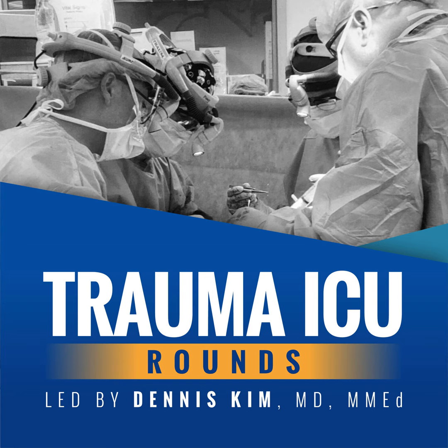So when patients come in really sick, what I have noticed at times is that in addition to being aggressively resuscitated with fluids and, let's say, being initiated on vasopressors to help augment systemic flow, I'll look over at the ventilator and the patient's actually chugging along with minute ventilations of 15 liters per minute. They've got minimal sedation and analgesia on board.